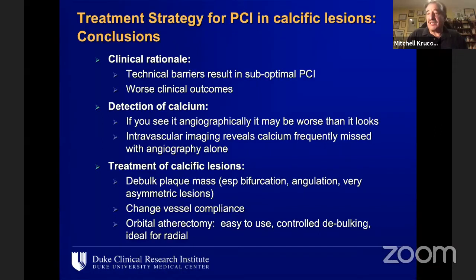sufficiently to change the clinical outcomes, we're currently enrolling in the Eclipse study. This is a prospective randomized trial between stenting and orbital atherectomy plus stenting in heavily calcified lesions. Enrollment was interrupted for about 3 months by the pandemic, but we are back enrolling again. And I think that'll give us a look at whether using more tools and creating better looking results translate to better clinical outcomes, but my prediction is it will.